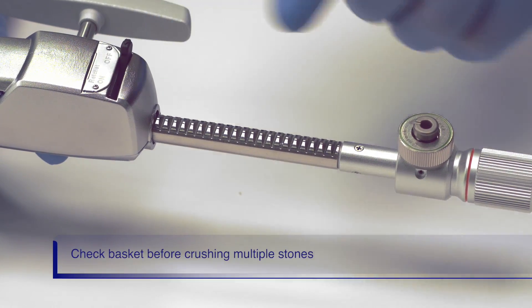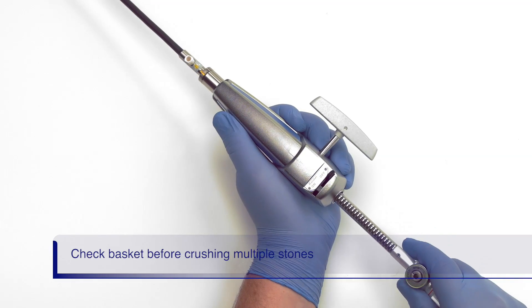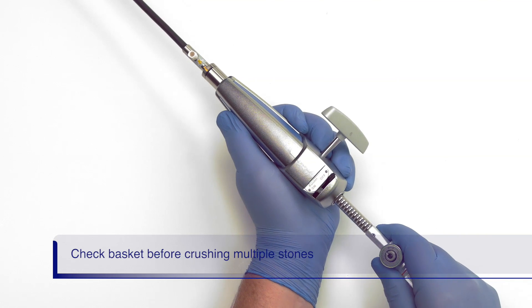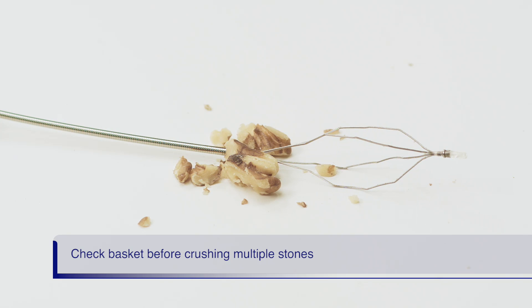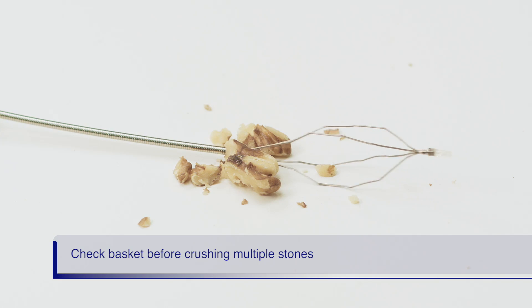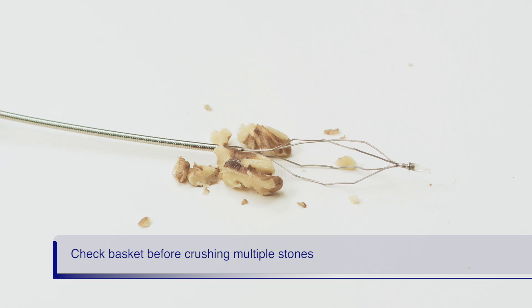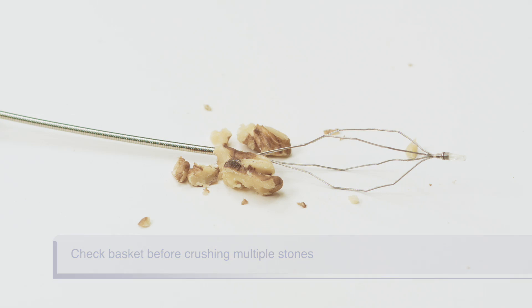Turn the ratchet off and check that the basket can reopen smoothly. Apply gentle pressure to the back of the handle to reopen the basket. Smoothly open and close the basket before crushing additional stones. If the basket does not smoothly open and close, then remove it from the patient and use a new basket to ensure no trauma is done to the duct.